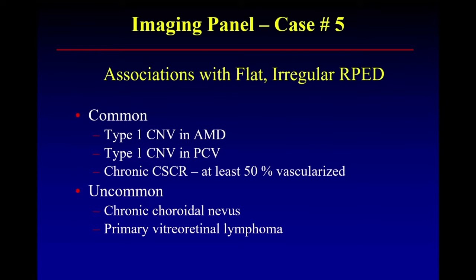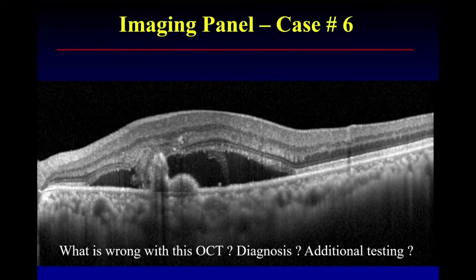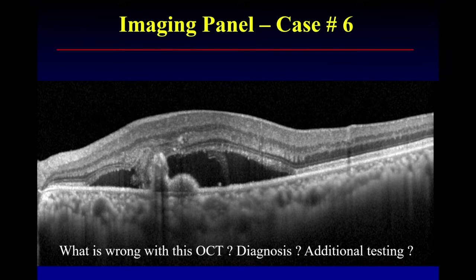Sung, you're going to have the next case. What's wrong with this OCT and is this pathognomonic? I see subretinal fluid, outer segment and ellipsoid zone elongation, some PED with internal reflectivity, and increased reflectivity from the RPE. I think this can be polypoidal. Any other possibilities other than polypoidal? It could be type 1 CNV, but it looks more like polypoidal. Can you diagnose polypoidal just from this scan, or do we need ICG as well?